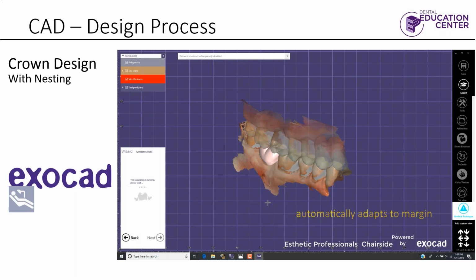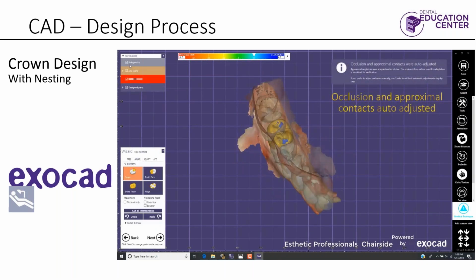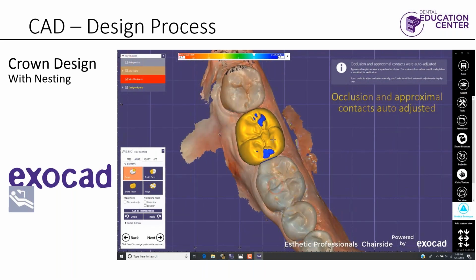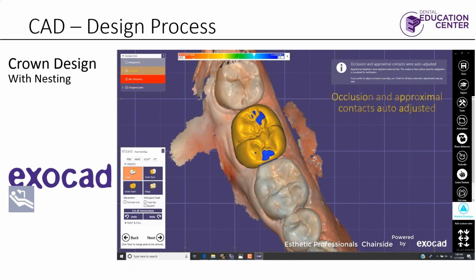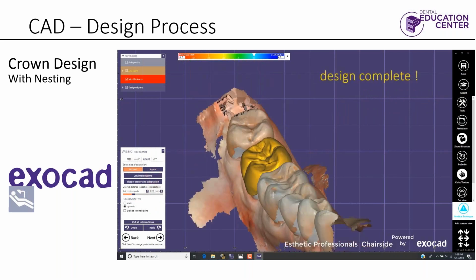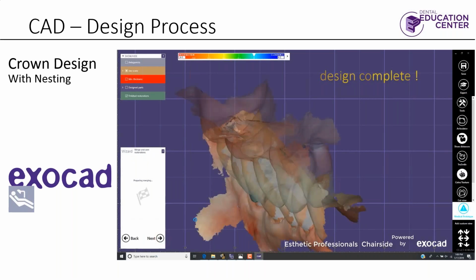You can see it adapts to the margin that we selected. Finalizes the restoration.